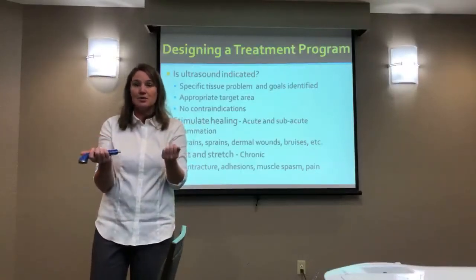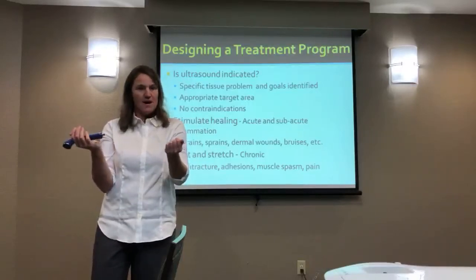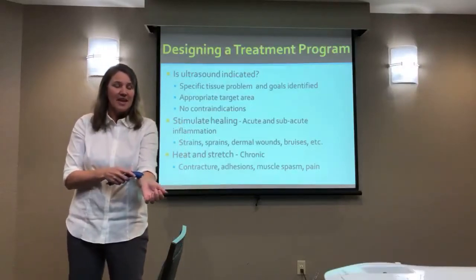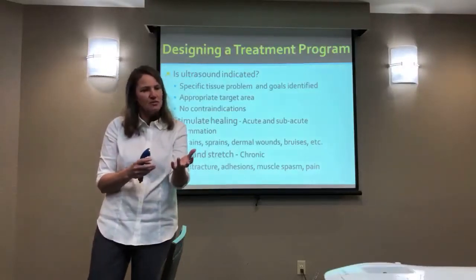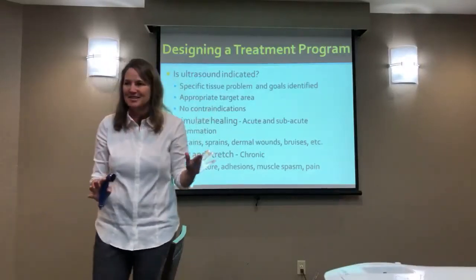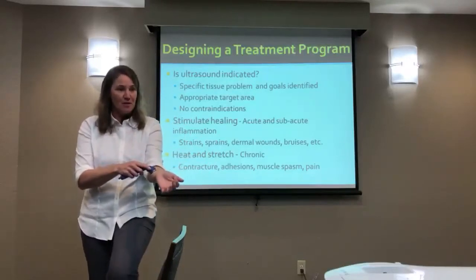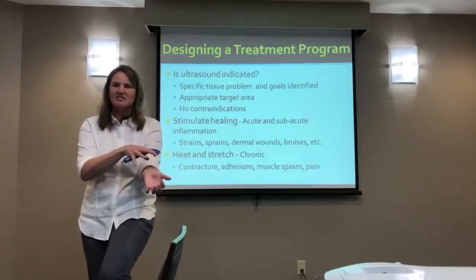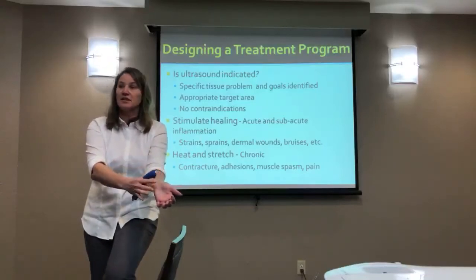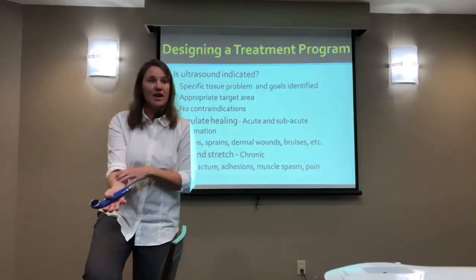But I remember being skeptical about non-thermal ultrasound. And so I thought, oh, I could do a little study. So I did non-thermal ultrasound on my left forearm. And lo and behold, I should have written up a case study, but you know, this is a very, very minor study when it comes to studies, no control. But I ultrasounded my left arm, and those bruises, you know, did that change into yellow and went away, and that arm was all healed up and cleared before this one was. So I thought it was really interesting, you know, that I had a resolution.